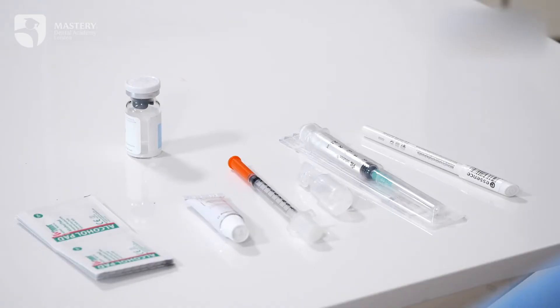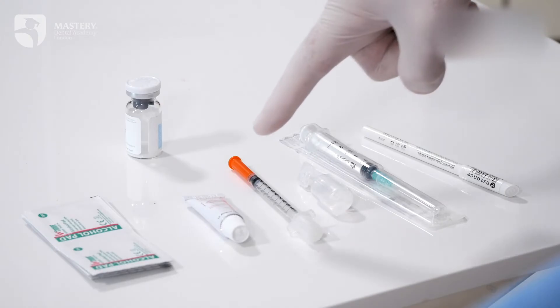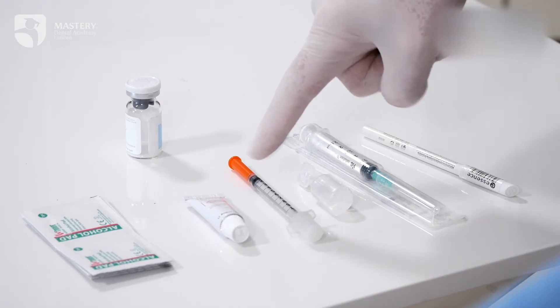I'll show you what we need to start doing the Botox. In the session of Botox, you should have around you the major materials, like alcohol pads and topical anesthesia, just to make things easier for the prick.